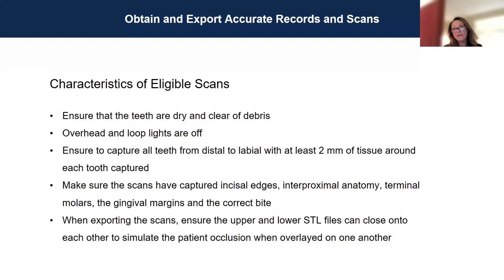And then when you're exporting the scans, you want to make sure that upper and lower STL files can close onto each other to simulate their occlusion. And you want to make sure the teeth are dry and clean of debris, especially our teenagers, right? That come in after school and mom gave them a granola bar. Give them a toothbrush.